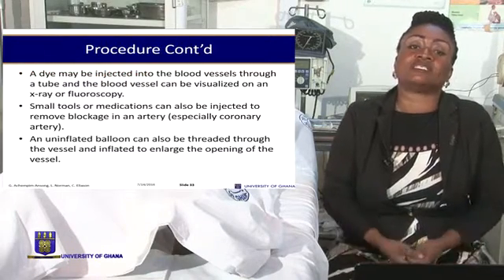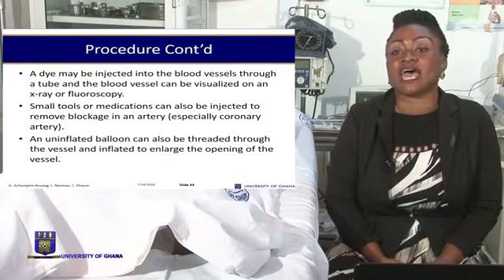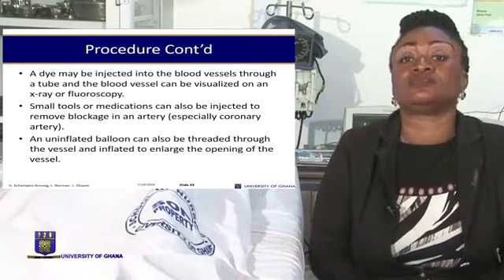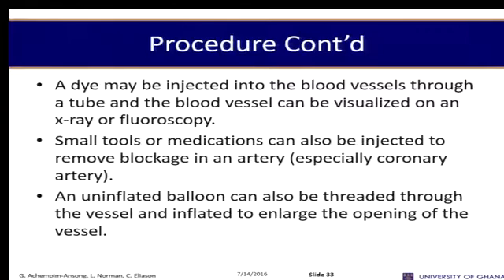Then I would now bring in angiography. In angiography, a dye is introduced through cardiac catheterization into the heart chambers for visualization. So I said earlier that cardiac catheterization and angiography are done hand in hand.